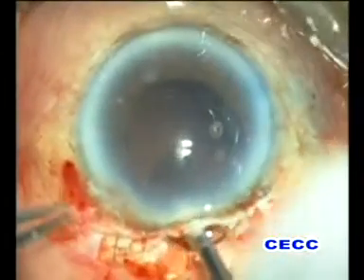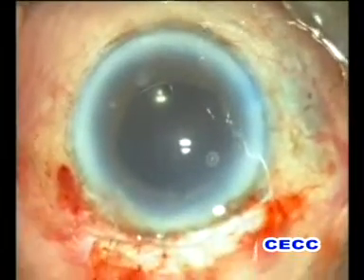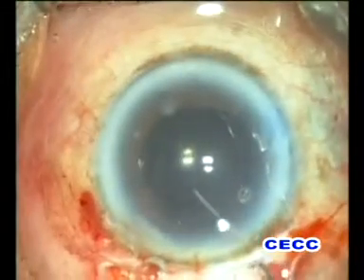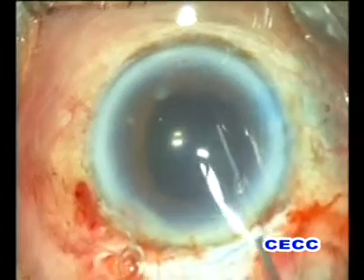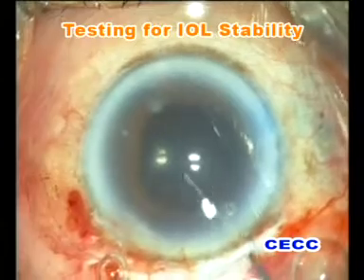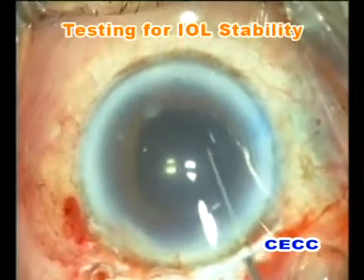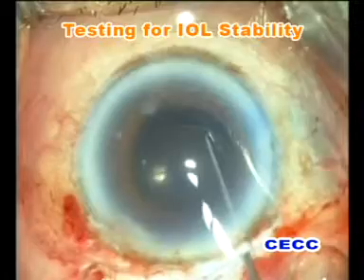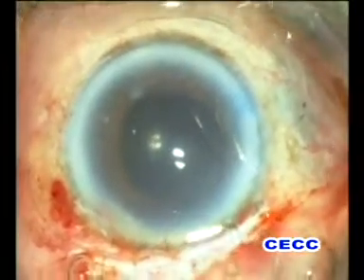A rigid 6 mm by 12.5 mm single-piece all-PMMA posterior chamber intraocular lens is implanted in the capsular bag. The stability of the lens is checked and the intraocular lens is found to be stable. Subsequently, the pupil will be constricted with intracameral injection of pilocarpine.